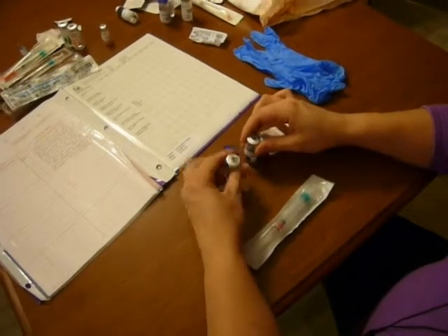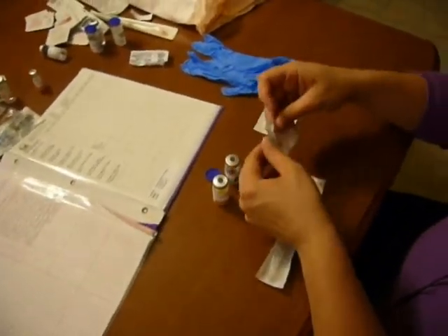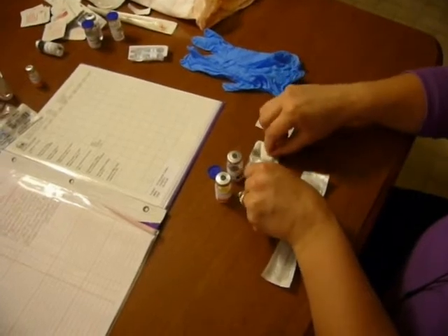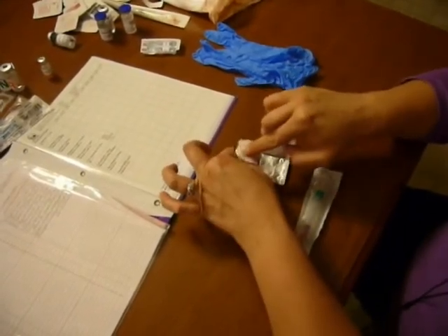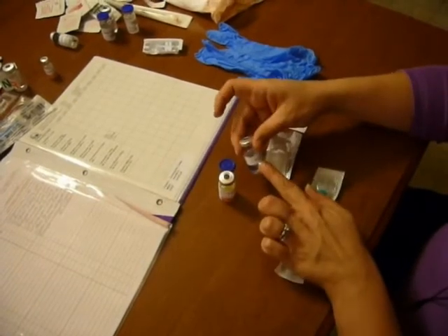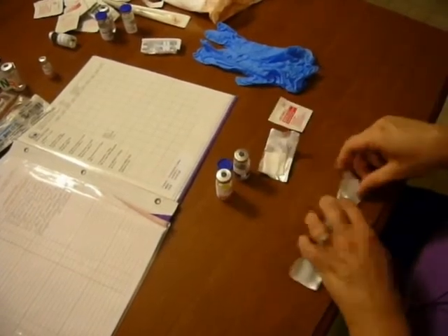I'm going to take off the covers, rip down the sides, and open my alcohol to make a sterile field. I'm going to alcohol off the top of both of the vials, making sure that I have plain diluent here to mix in because that's what it tells me I need to do.